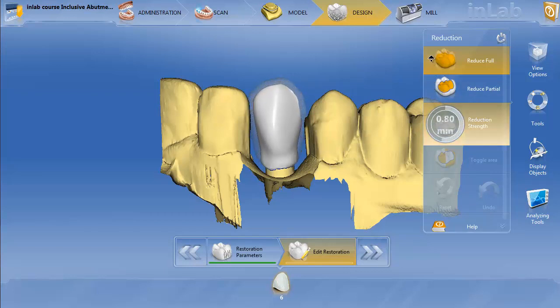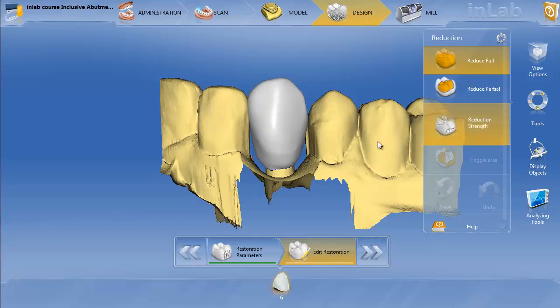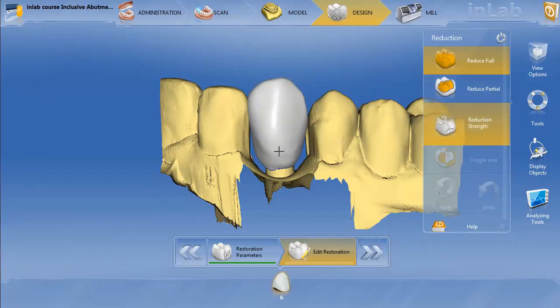You can see as you reduce it, the transparent crown appears in the background and then you can see the reduction coping that's actually in the middle. But we don't want to do that. What we want to do is a partial reduction, because we want to draw our custom line where we want this reduction to take place in relation to the actual gingiva.